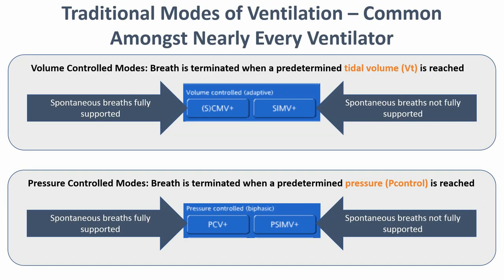There are multiple different modes of mechanical ventilation. These are traditional modes. We're not going to use these modes very often, except for one pressure control mode, PCV plus. But it's helpful to know what the other modes are and what they do, because ventilator terminology is not uniform. You may be transporting a patient from the hospital who is on one of these modes, and it's also helpful because it helps you understand our specific ventilator too.